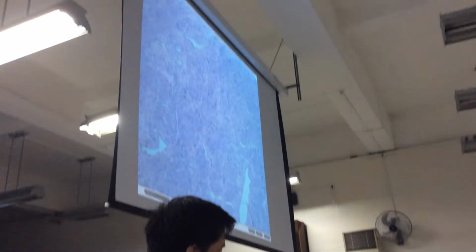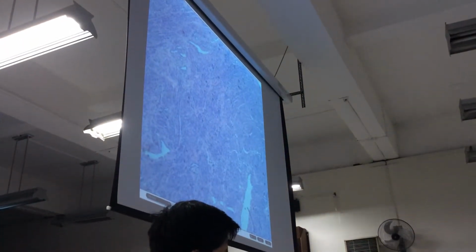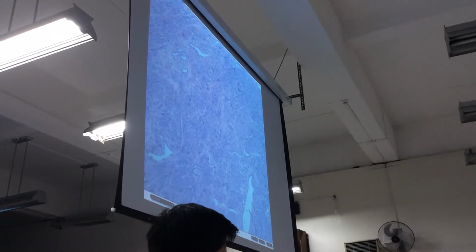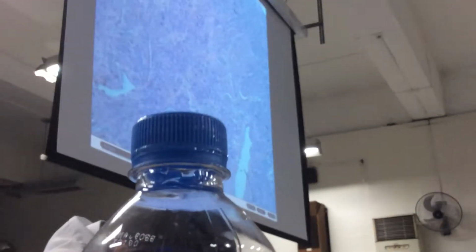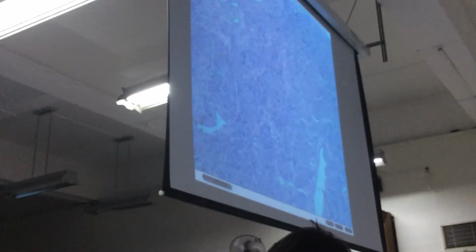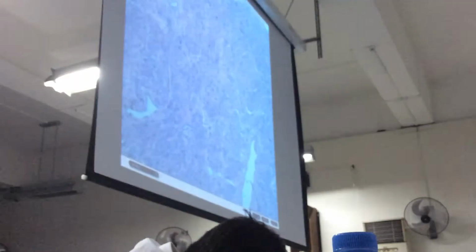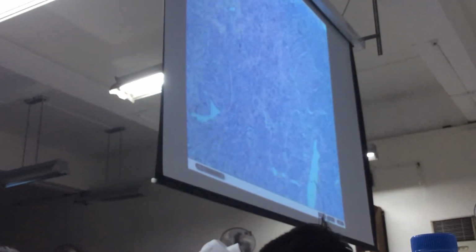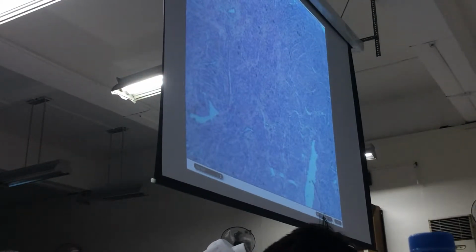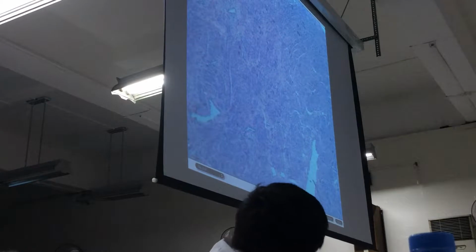In your slide boxes, M1001 is hypertrophy of the uterus, M1005 is squamous metaplasia of the cervix, and M1004 is a condyloma lesion, condyloma acuminata. It's labeled in your slide boxes as apoptosis skin, but that's a squamous papilloma with koilocytosis, so that's condyloma acuminata.